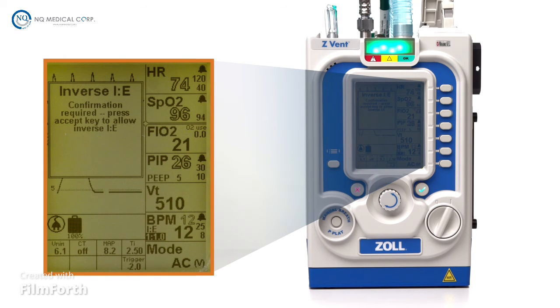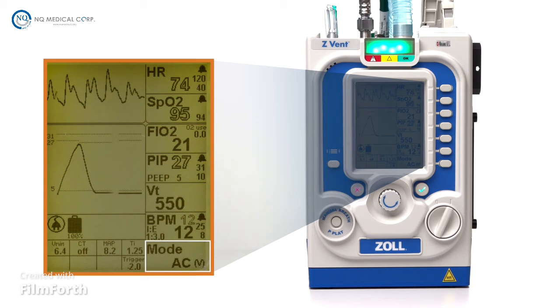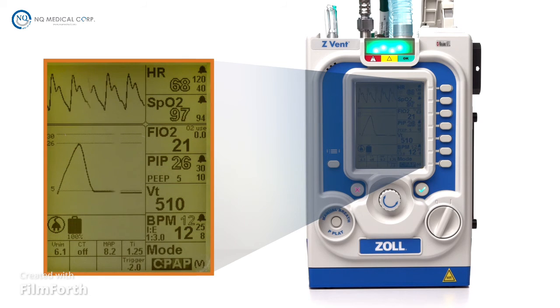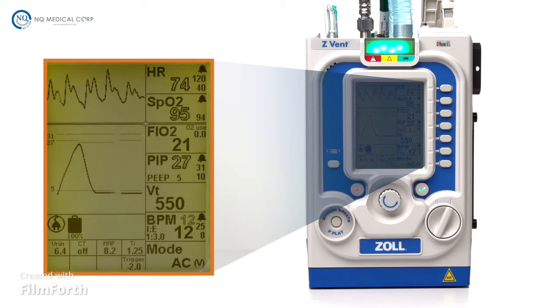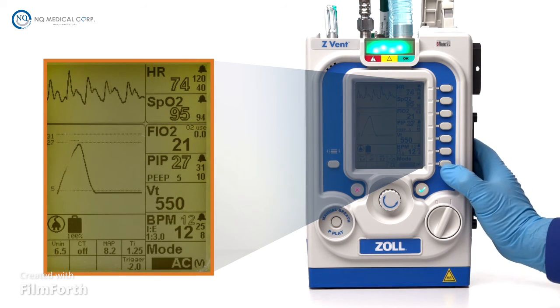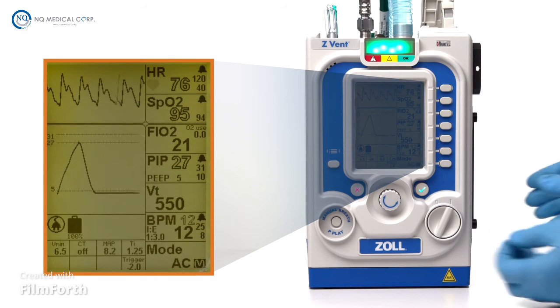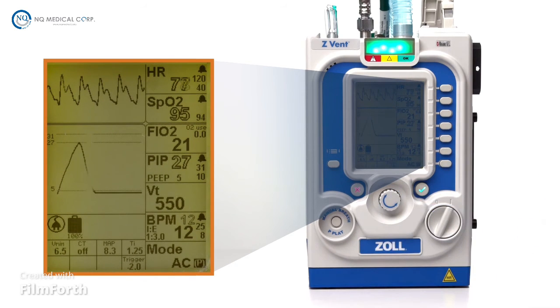The seventh parameter window is ventilation mode. The Z vent has 4 primary ventilation modes: assist control, SIMV, CPAP, and bi-level. Press the parameter button once to change the desired ventilation mode and twice to change whether to operate in volume-targeted breathing mode or pressure-targeted breathing mode.